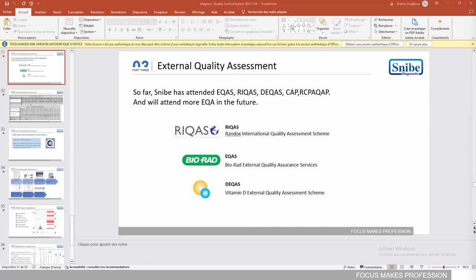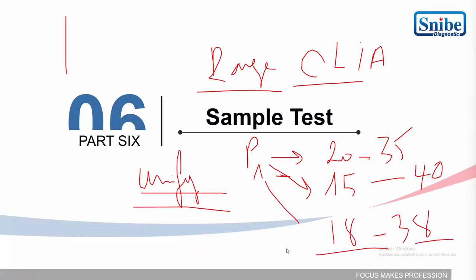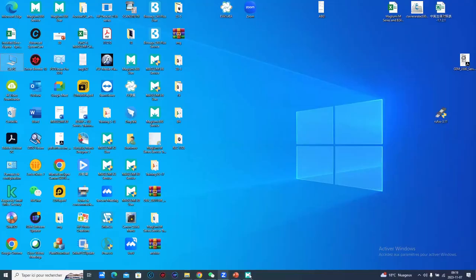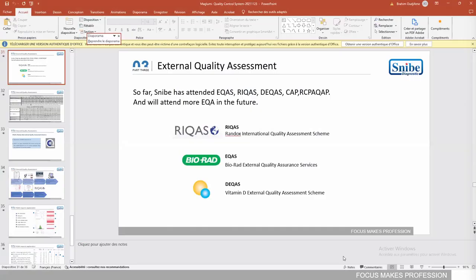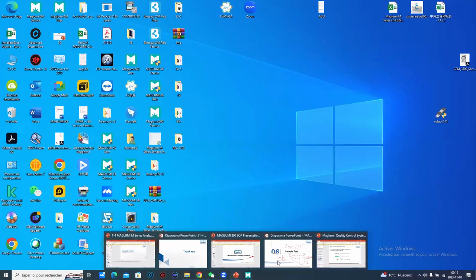Yeah, everyone has his own range because everyone is using different material for the separation. You know, the main important step in the CLIA test is the separation technique and the labeling technique, and all of them are using different techniques.